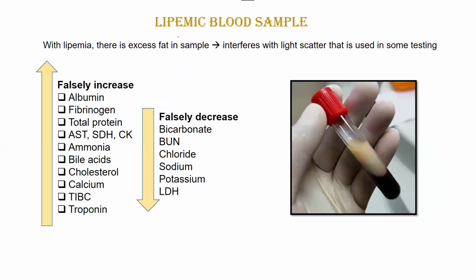Next we have lipemia. A lipemic sample looks like this, it has a cloudy appearance.